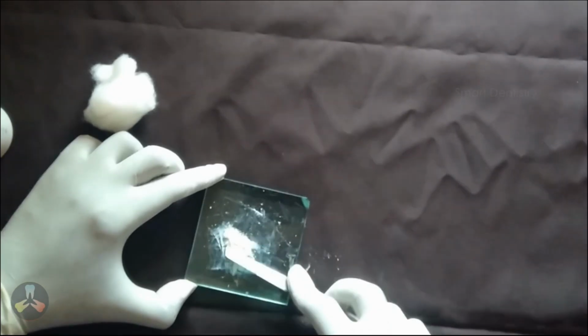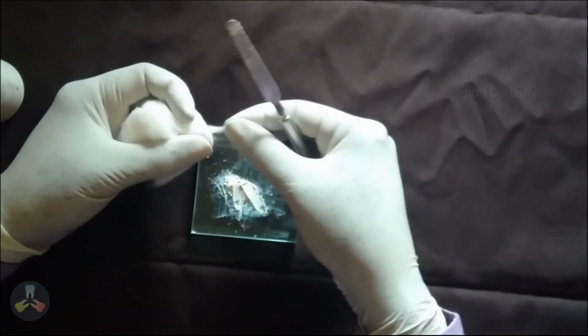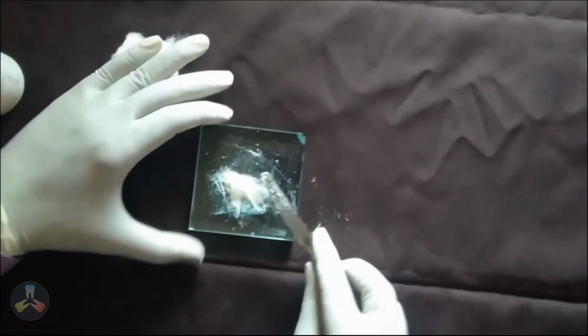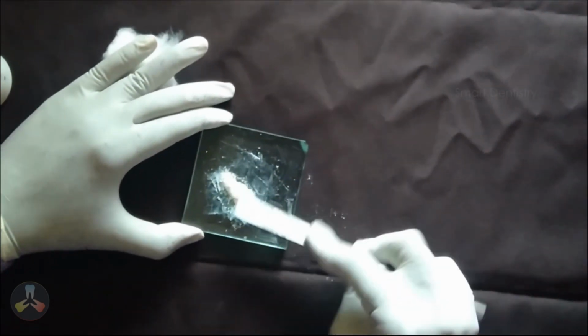I am using the zinc oxide and the eugenol, the conventionally available. Both are taken on a glass slab. We are going to mix it as usual. We will get a very good thick mix of zinc oxide eugenol.